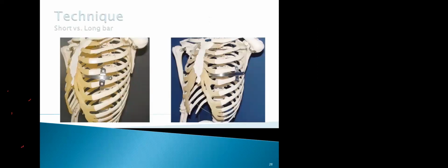This is all the concept and technique of a Nuss procedure. If you look at that, there is a sternal bar. This is a steel bar. You can also have a titanium bar, but if you get a titanium bar, you need to prefabricate them. These steel bars come straight, and then we bend them as per patient's need and then use them. As you look at that, the stabilizer lies on the ribs, and the bar is pushing the sternum forward. Basically, that's what this operation does.